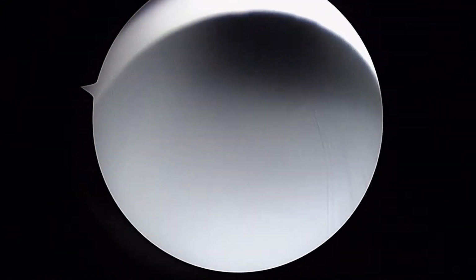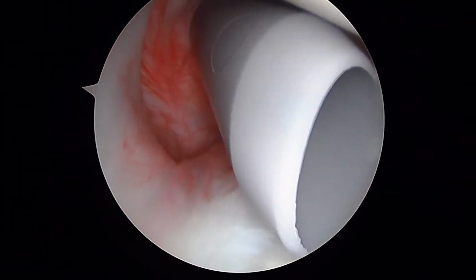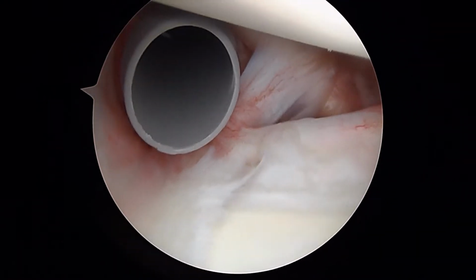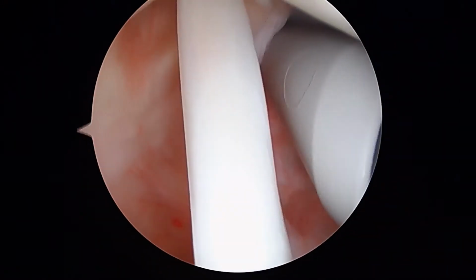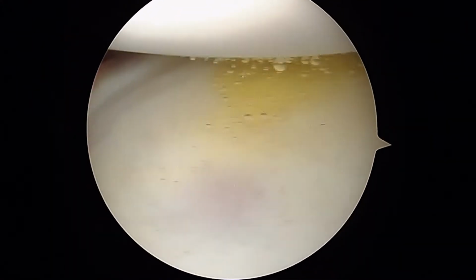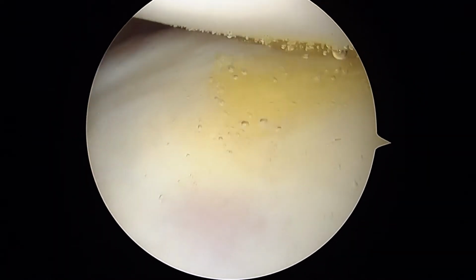Hey, it's Dr. Buford. We're just getting started on the right shoulder. We're looking at from the back to the front. You're laying on your side, so your arm is up in the air. The humeral head, or the ball part of the ball and socket joint, is the top half of the screen here. Your glenoid, or the socket part of the joint, is the bottom half of the screen down here.